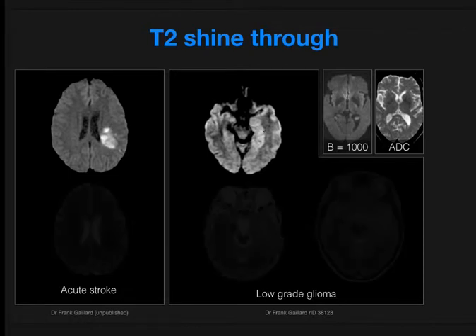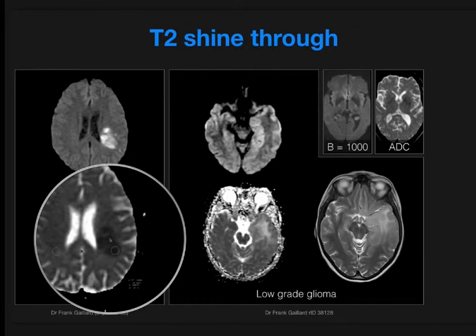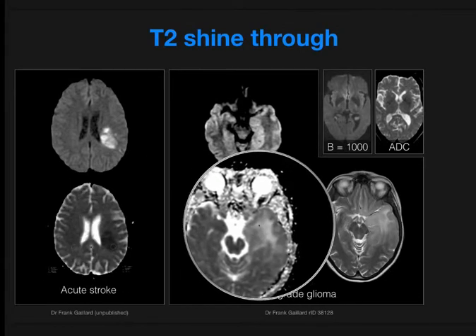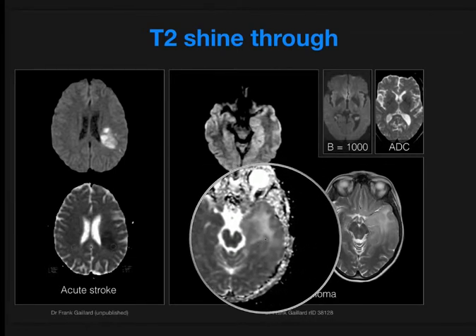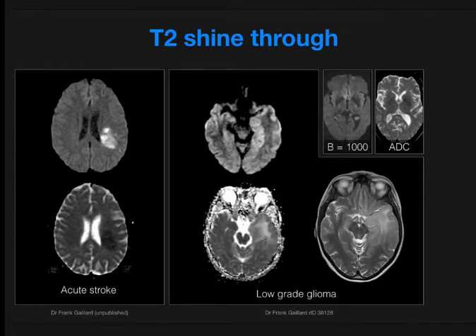We would always want to review ADC maps. On this side we can confirm that the restricted diffusion is abnormally high — the ADC values are lower than normal, blacker than what that tissue should be — whereas in the low-grade glioma that tissue demonstrates higher signal intensity on ADC, so higher ADC values. This is not restricted diffusion but rather facilitated diffusion, and we would say the high signal on DWI is due to T2 shine-through. In fact, all diffusion-weighted images have a combination of both T2 signal and diffusion depending on the tissue.